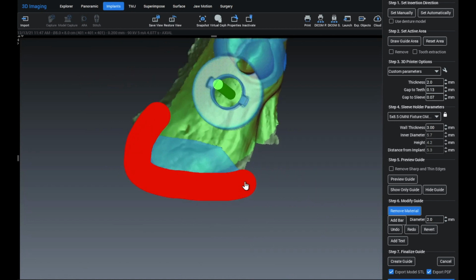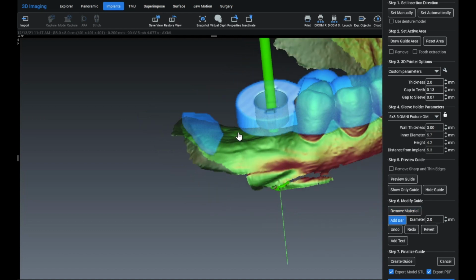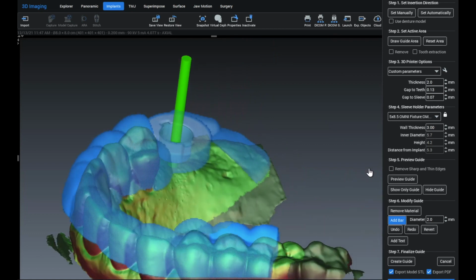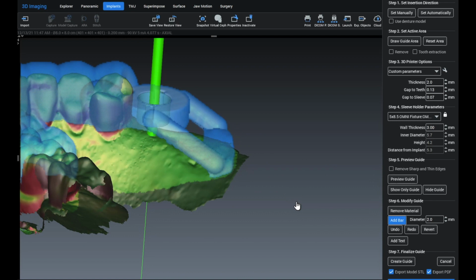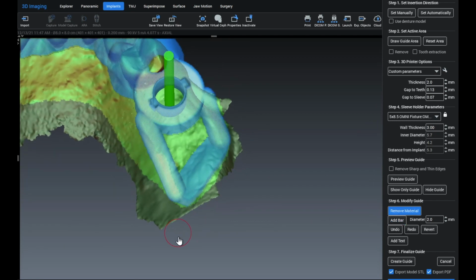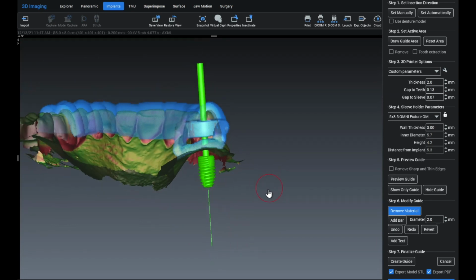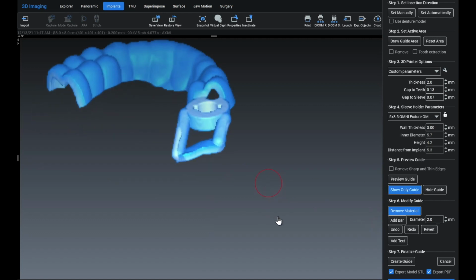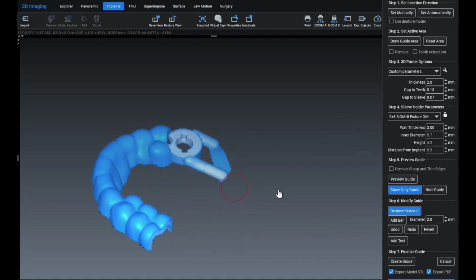Now, you do want to make sure you trim at the lateral boundary of the intraoral scan. That way you don't have any artifact of the surgical guide that may not seat correctly. So this is it. This is about all the surface area you need. And then we're going to connect it with 2 bars. And you want to make sure that you have eliminated some of that mesial distal space if you're planning to flap the case. This case, because it's in the maxilla, plenty of keratinized tissue, we might just do it flapless. But if you were going to flap it, you need to make sure you're giving yourself enough room to reflect your flap. So that's it.